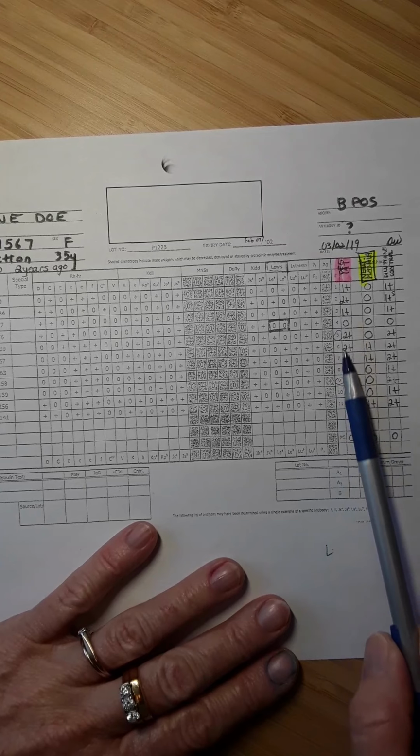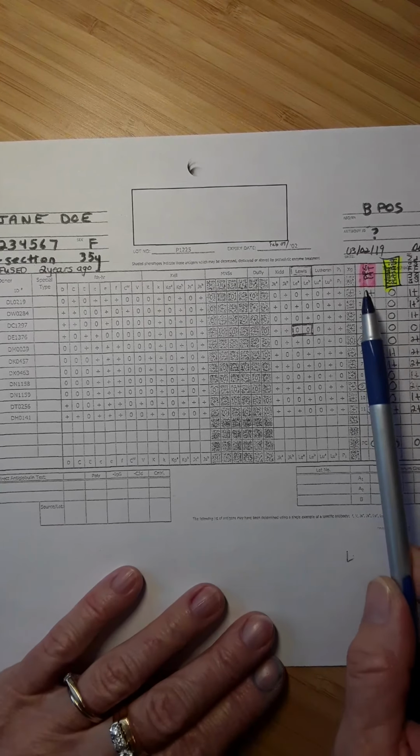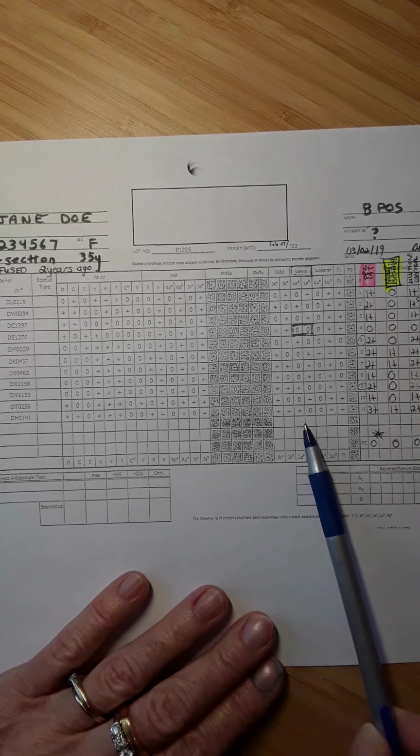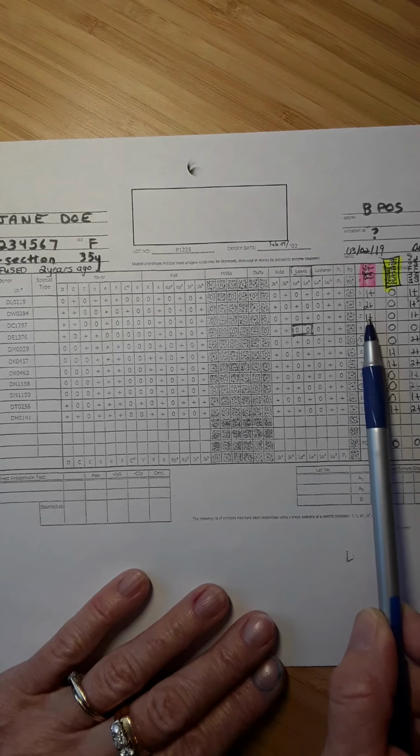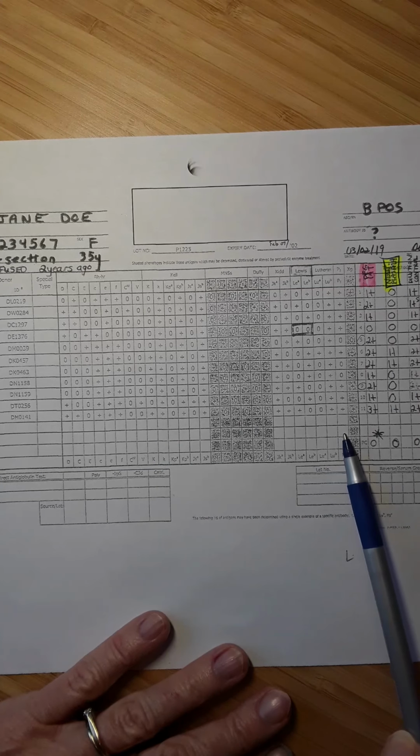I'm going to start thinking about what antibody or antibodies are present in the patient's plasma. When a patient reacts with almost every cell, it's very hard to see a pattern of reactivity.